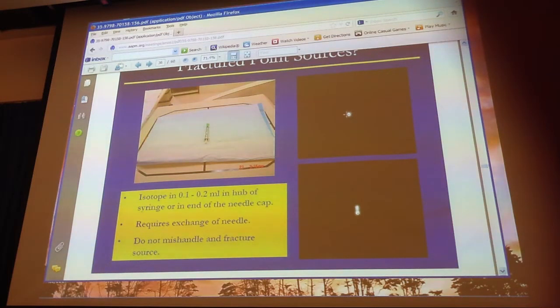This one is okay, there's no problem with this. Okay, let's say that I have 2 pulse height analyzers turned on, because what's the energy of indium? 247. Okay, 173 and 247. So that means that in this image here, both peaks are superimposed on each other. So what happened here then?